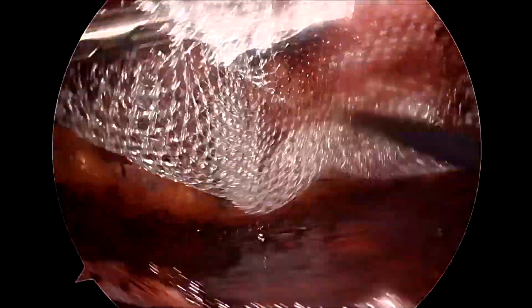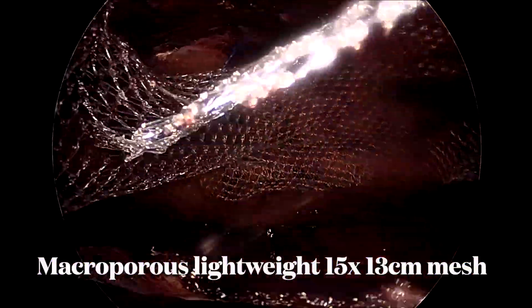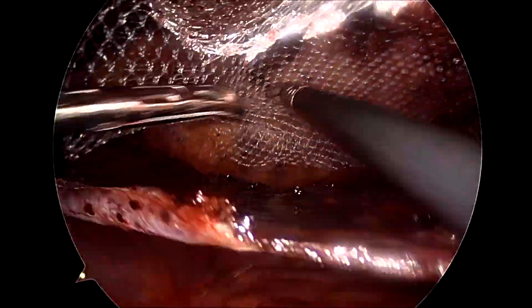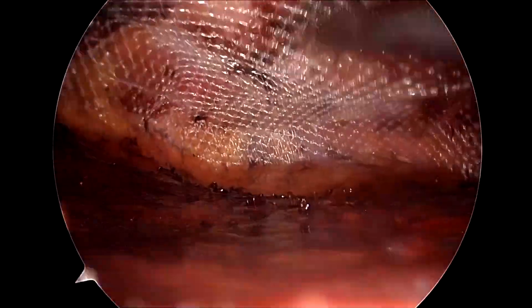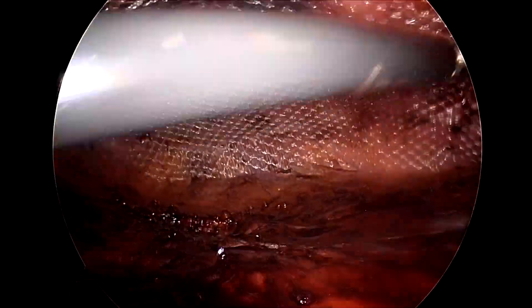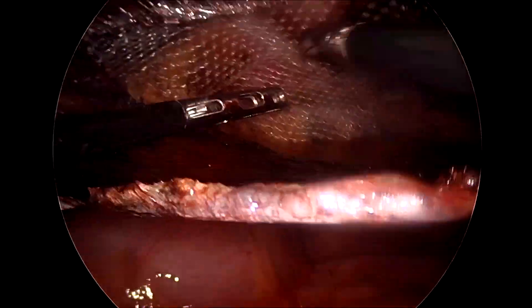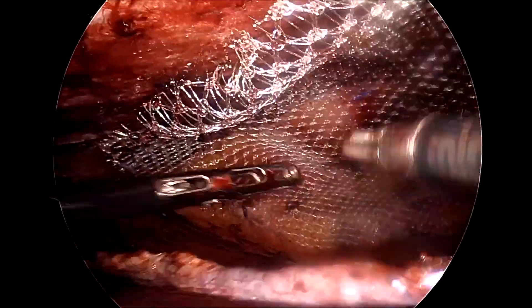Normally we use soft macroporous mesh for primary ventral hernias like in this case. Here I have taken a 15 x 15 centimeter soft mesh, and cranio-caudally I have kept it 15 centimeters while transversely I have trimmed it by 2 centimeters, so the effective size of the mesh used here is 15 by 13 centimeters.